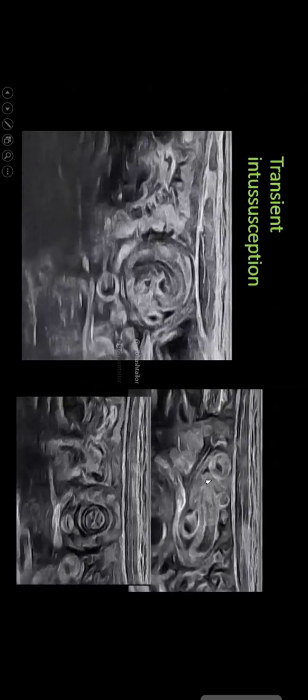And there is transient intussusception with some rounded target-like abnormal structures within, and the structure is long, tramtrack-like. Transient intussusception with a small dot-like area within it, which on long scan is a tortuous elongated structure within the bowel lumen.